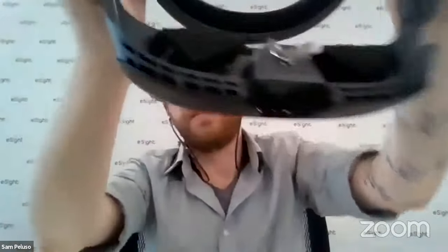And on the inside of the visor, there are measurements, so you can set a pupillary distance for a person. And once those are set, you don't have to touch them ever again. But if you want to let your friend try the device on, then all you have to do is adjust it. They can slide the prisms into the position that they need for their pupillary distance. And then when you put them back on, you can just adjust them back yourself.